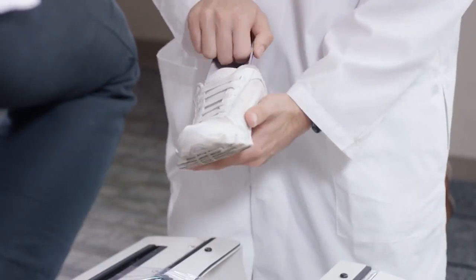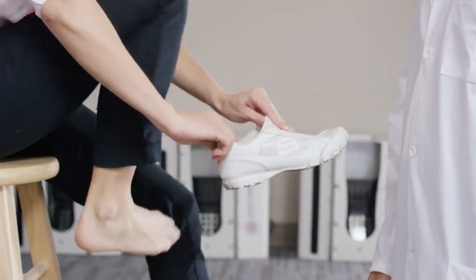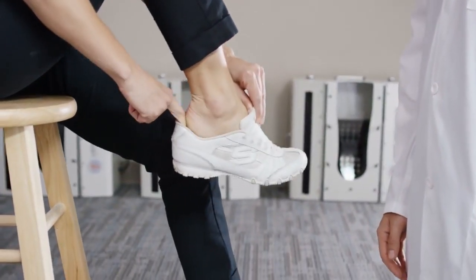Your patients can now walk out of your office in only one visit and experience the immediate benefits of having a pair of comfortable custom molded orthotics in their shoes.